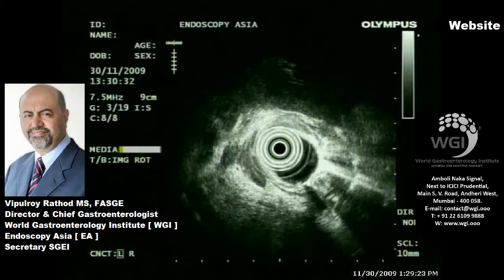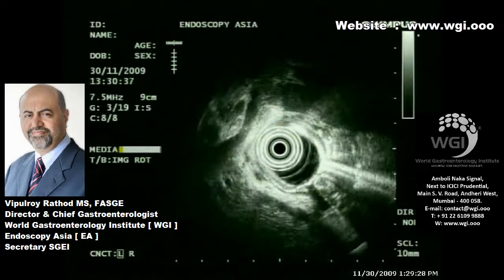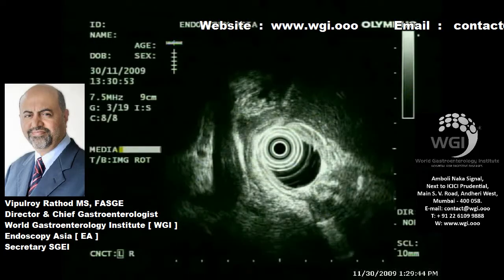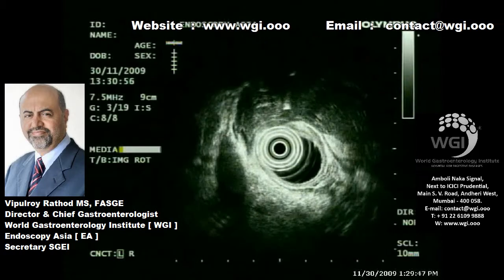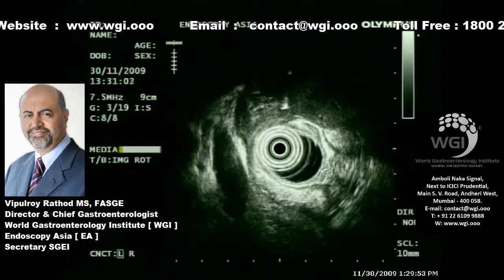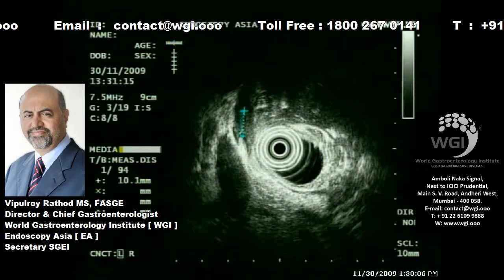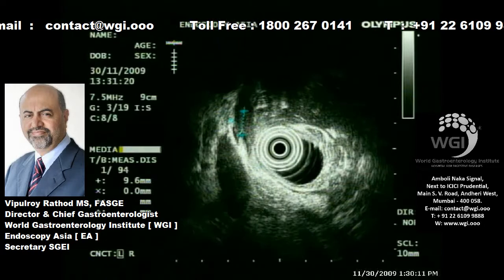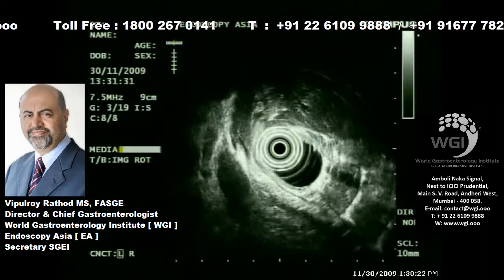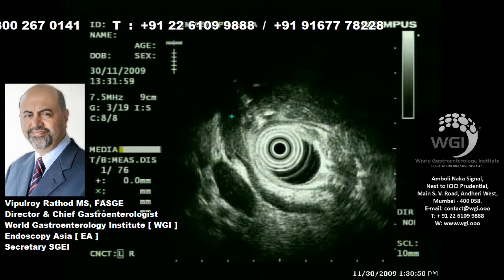This is a case of a 65-year-old lady who underwent a cholecystectomy a year back for gallstones and was referred to us with obstructive jaundice for EUS and ERCP. Here I am seeing the entire length of the lower CBD and I can see a hypoechoic stricture which I am measuring in the bile duct — it measured around one centimeter. We focused our evaluation on the lower CBD as well as the lesion seen at the CHD. The hypoechoic thickening is very well appreciated on sonography.